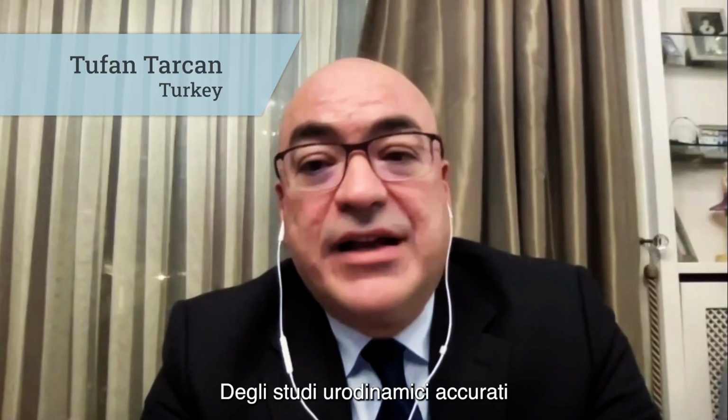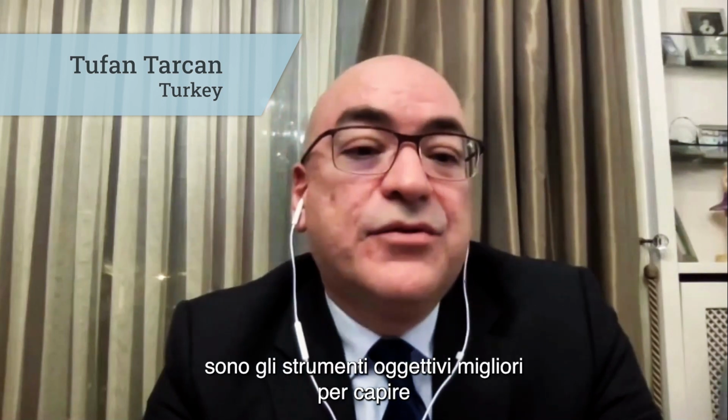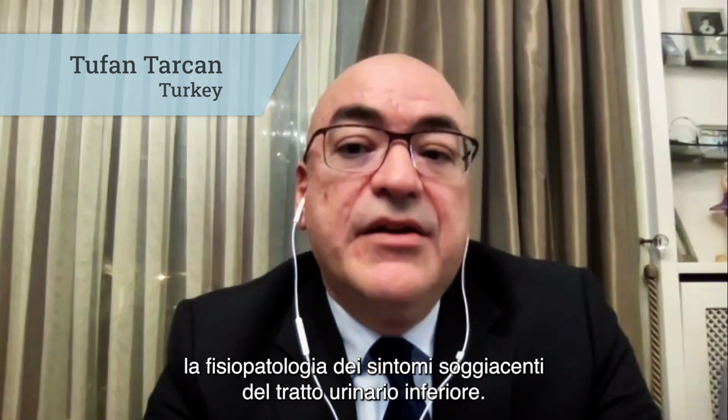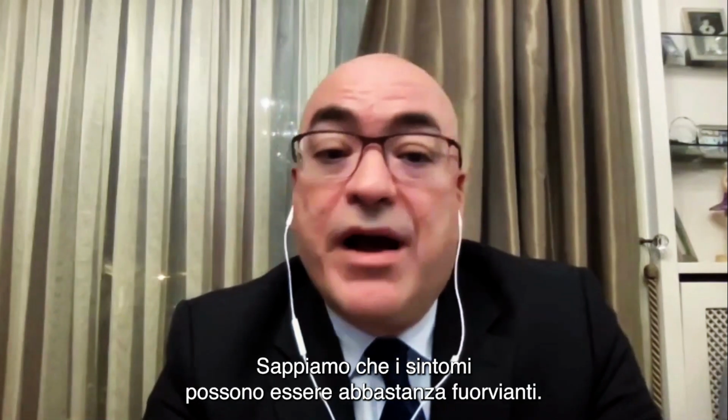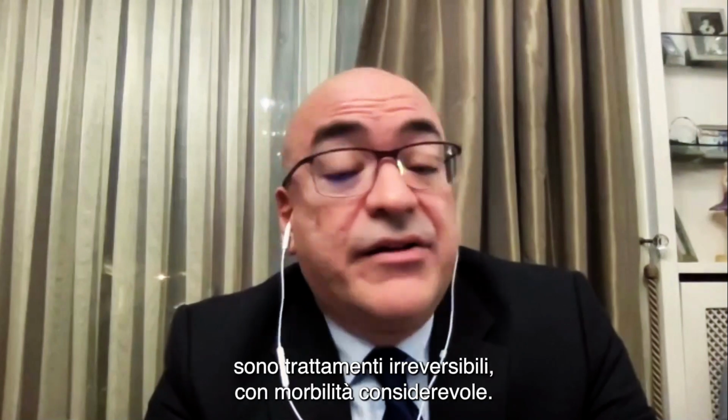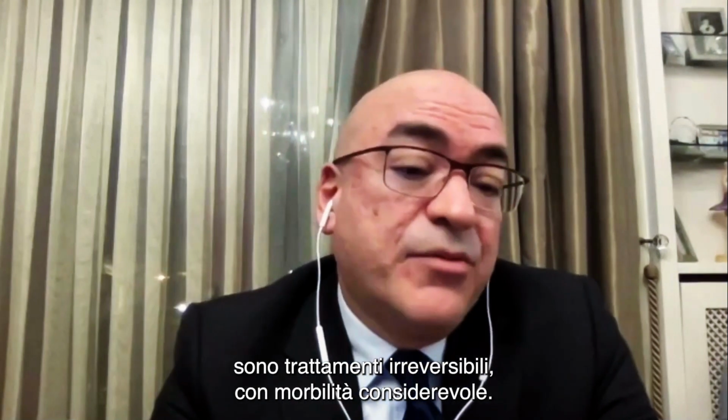Properly performed urodynamic studies are the best objective tools to understand the pathophysiology of underlying lower urinary tract symptoms. We know that these symptoms may be quite misleading. With urodynamic studies, it's more likely than any other tool to reach the objective diagnosis and so decide on specific management rather than utilizing empirical treatments. This is especially needed before applying irreversible or surgical treatments. What we are offering as surgical treatment to our patients are irreversible treatments with considerable morbidity.